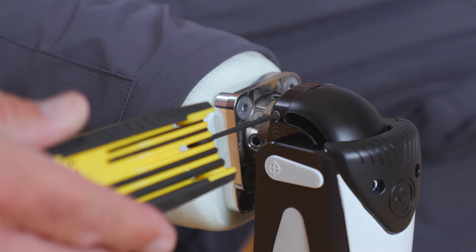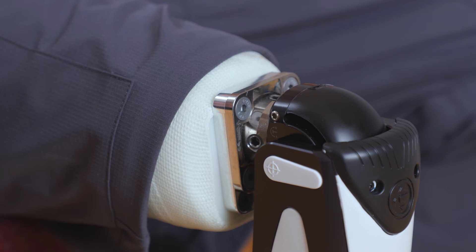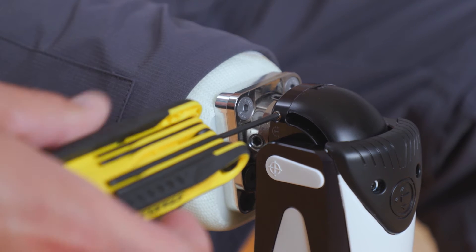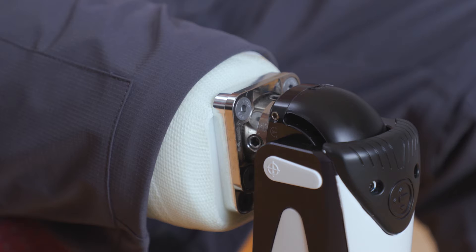The trigger point resistance adjustment is not a hydraulic adjustment, but rather controls how easily the Capital triggers into the low resistance flexion mode at terminal stance. Turning the screw counterclockwise makes the knee easier to trigger, while turning it clockwise requires a more deliberate movement to trigger into swing.